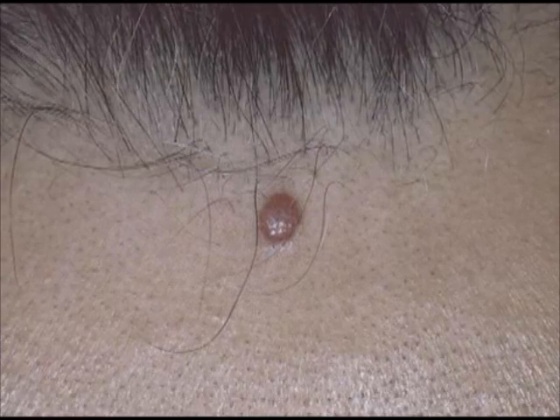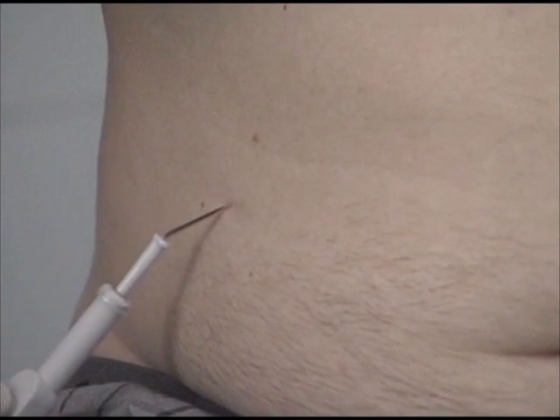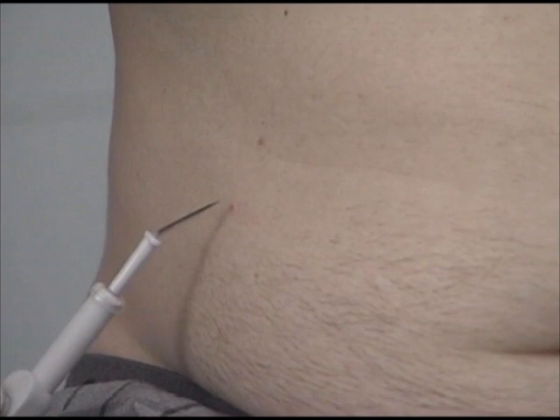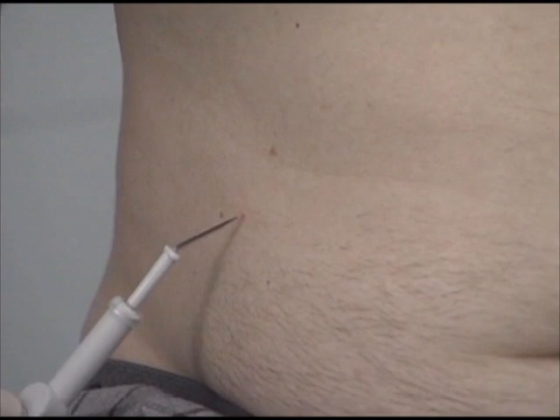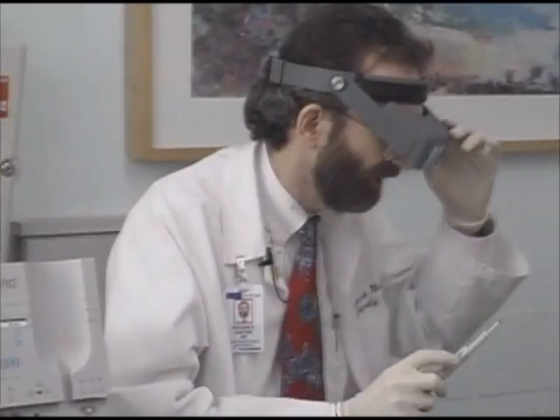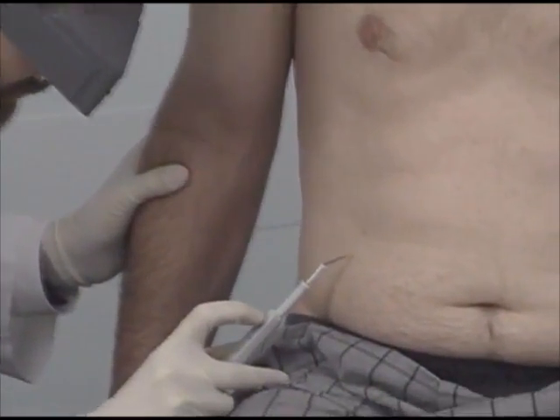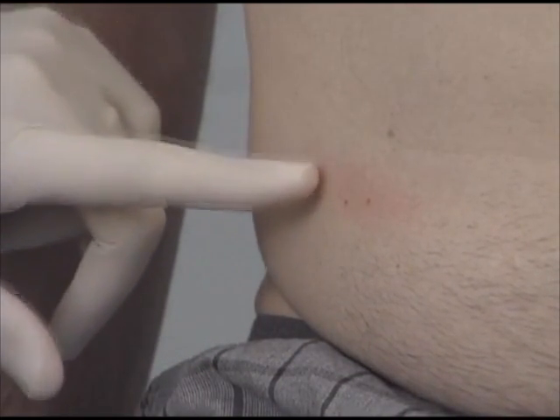Cherry angiomas are benign lesions. Patients may want them removed for cosmetic reasons. I am doing this procedure without anesthesia because the cherry angioma is small and the anesthesia may hurt more than the actual electrodesiccation. I started with 1.5 watts and did not get sufficient destruction, so I am now turning up the power to 2 watts. When not using anesthesia, it helps to stabilize your hand against the patient's body or face so if the patient moves, the electrode moves with the patient. I touch the electrode to the cherry angioma until the red color blanches and then activate the electrode. The red color turns to brown. A temporary faint pink blush surrounding the treated lesion is a normal response.